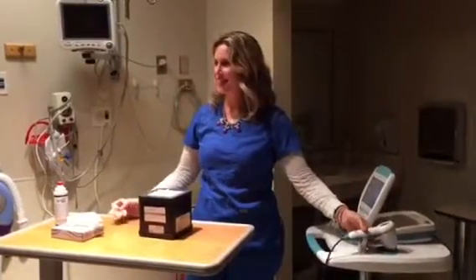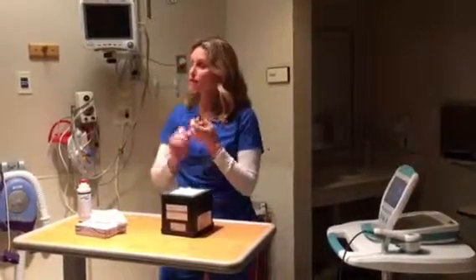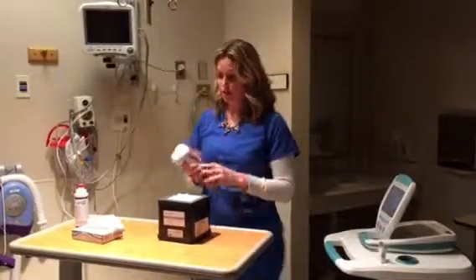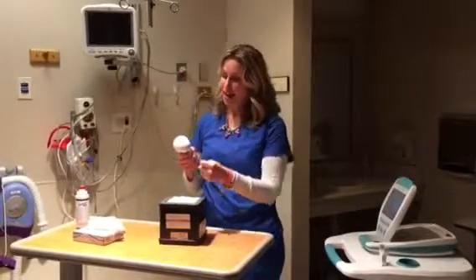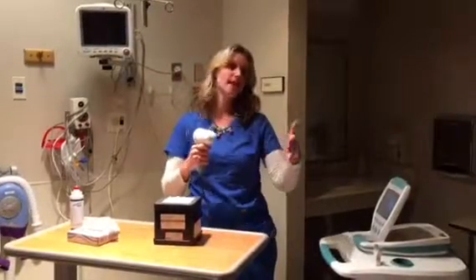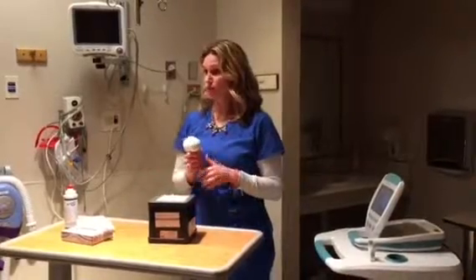So we do need the big blob. You need the big blob, that's for sure. If you ever get a reading of 0, if you have a patient that has a great deal of tissue, and you get a reading of 0, and you know that they have urine in their bladder, I would add more gel and then press more firmly and really push the adipose tissue back. Because at 12-inch scan range, you know that sometimes there's more tissue than 12 inches.